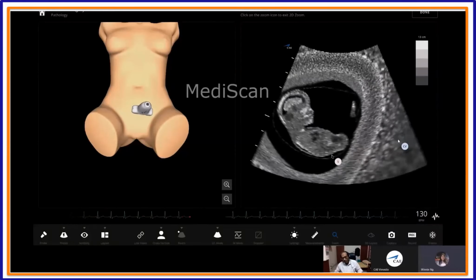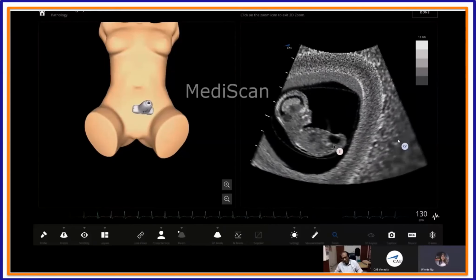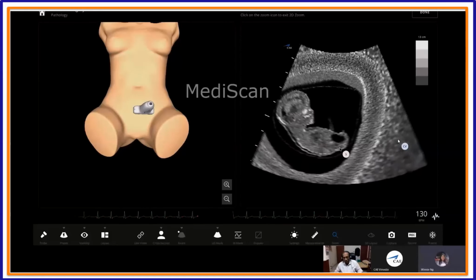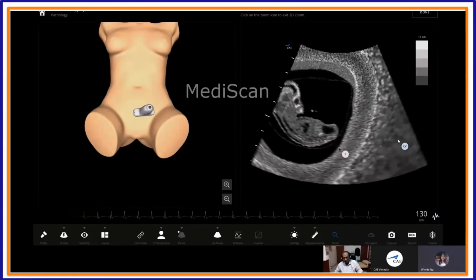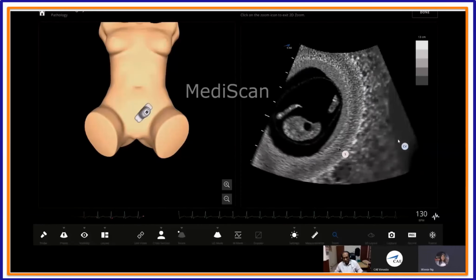So in the abdomen, I'm seeing in the lower abdomen there's a large cystic area. And obviously, it is in the midline. So I would like to rotate my probe and do a transverse section of the structure. Rotate the probe. Yes. Nicely.